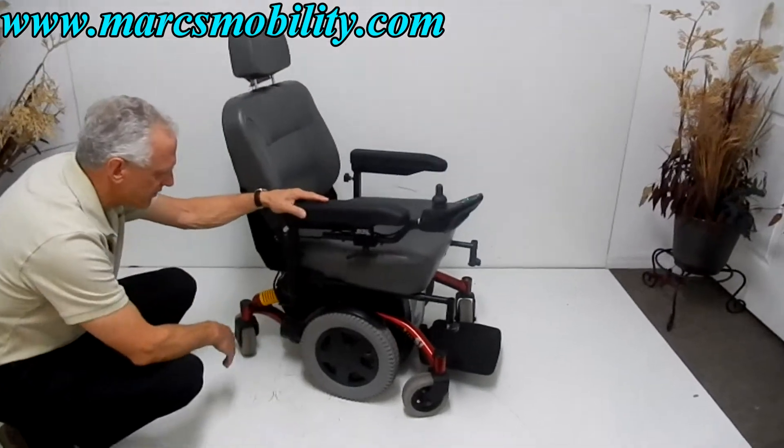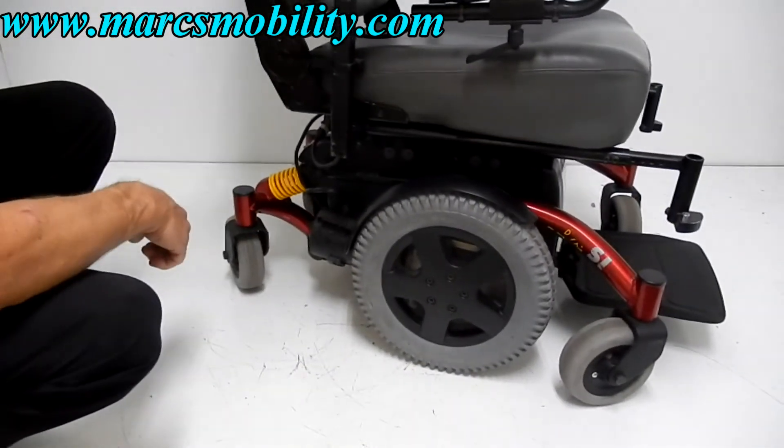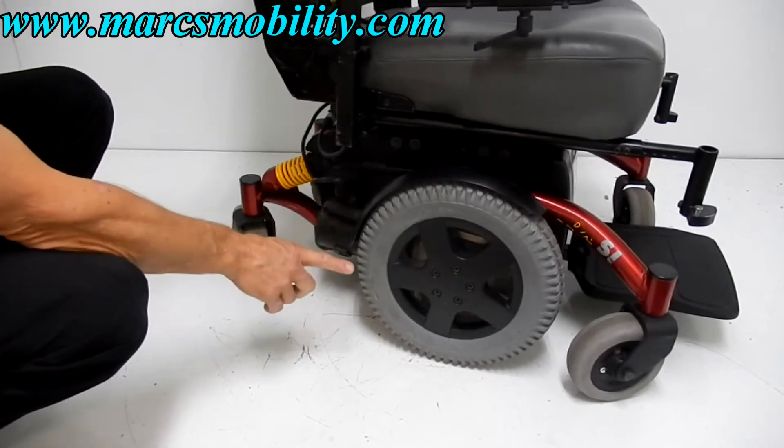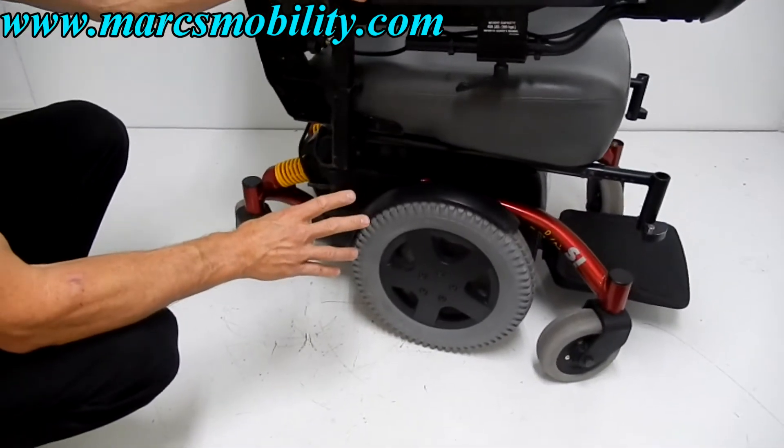It has 14-inch wheels and great suspension — you can see the suspension on both back sides. It has two motors, four-pole motors, which are the better quality motor when you have four brushes.